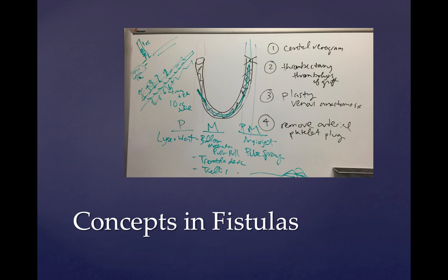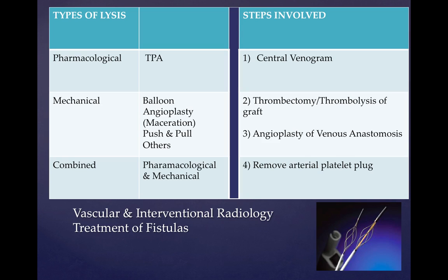Remember that this procedure is often called declotting. We talk about the treatment for AV loop grafts, and remember that we have native fistulas and we also have synthetic loop grafts, which are the ones shown here. While we focus on that type of graft, remember that anatomical variations sometimes require other types of grafts, and some of the treatment mentioned here will apply to native fistulas as well.